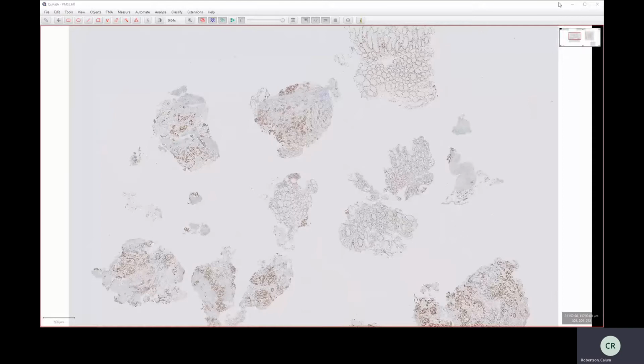Immunocytochemistry, as I said, uses exactly the same principles, but it would be based on cytology specimens. And histochemistry is another in situ test where we use special stains, but each of those stains differently, and I think it's probably best to leave that. You'll come across them in your practice.